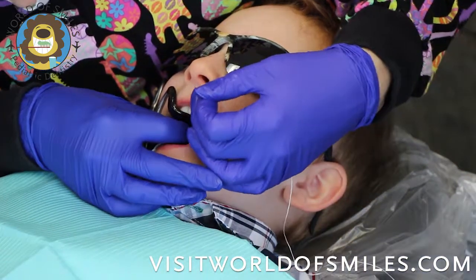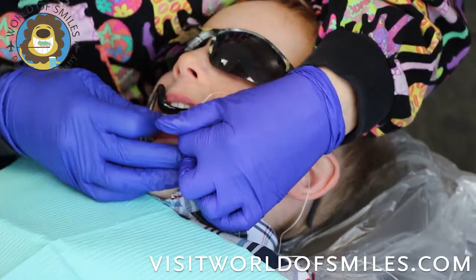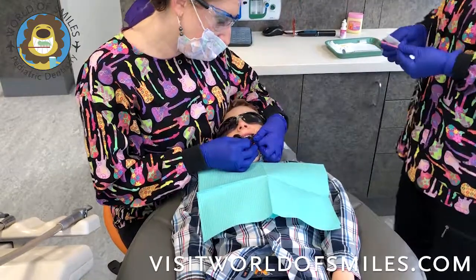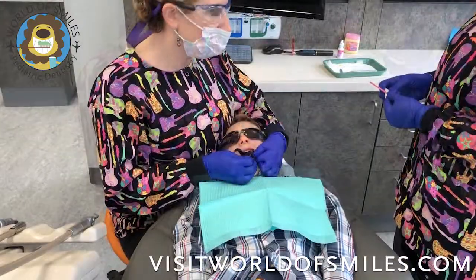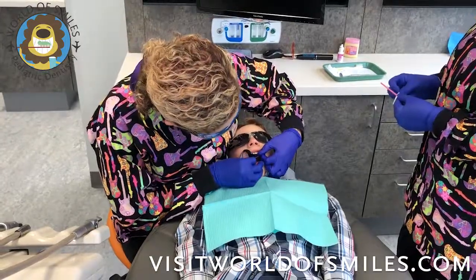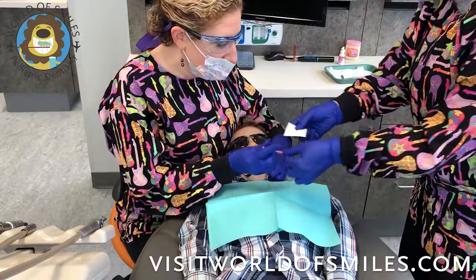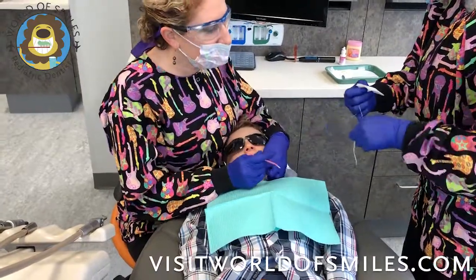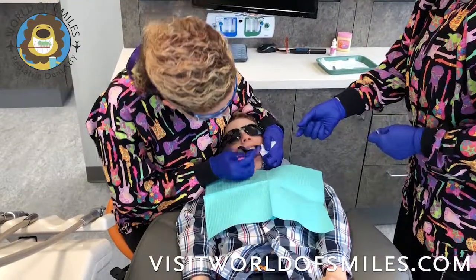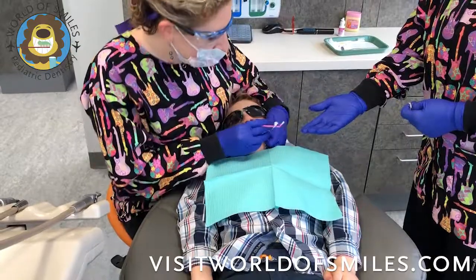You do want to be careful because of the staining potential. And now we have to wait one minute. After one minute has passed, we take out the super floss and dry off any excess with a 2x2, then apply a layer of fluoride varnish to lock it in.